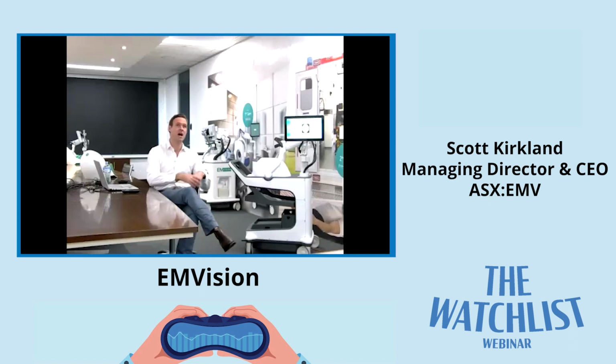So we're getting data to support the application of our device up front in, for example, rural and regional settings where there is limited CT access, to inform those really important transfer, triage and potentially treatment decisions, but also follow-up scans to help us understand response to treatment and complications. There's a whole host of things that can go wrong once a patient is in ICU or in the stroke ward.